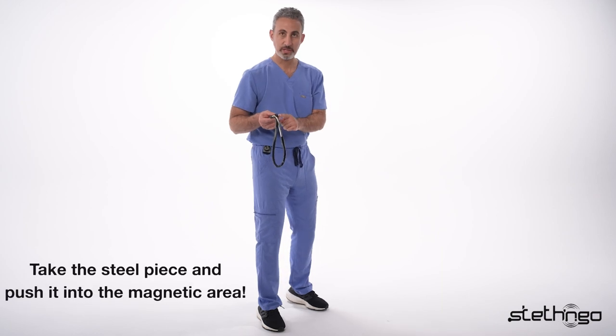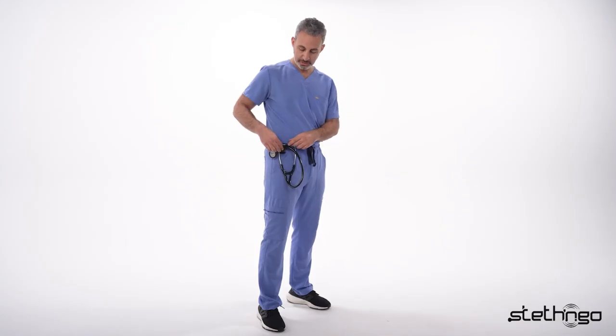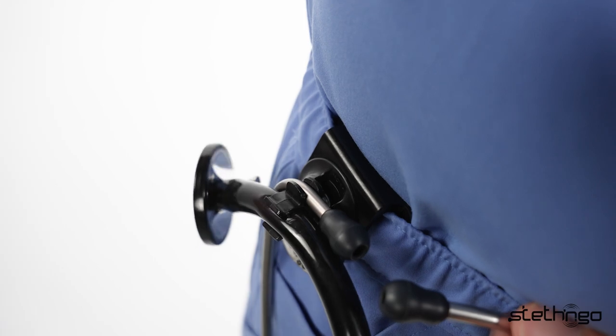You're going to take the steel piece and push it into the magnetic area. When you hear that click, you know your stethoscope is secure. Then you're going to take one of the ear tubes, use your thumb, and clip it right in.